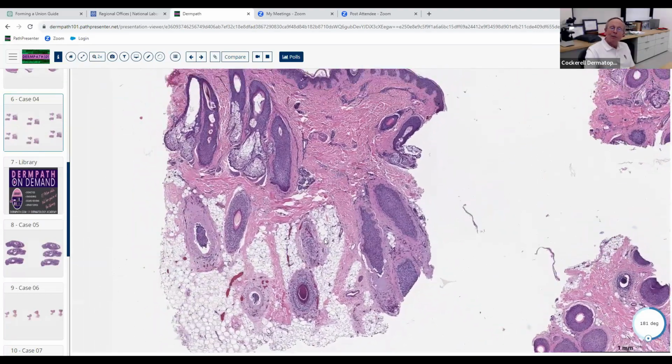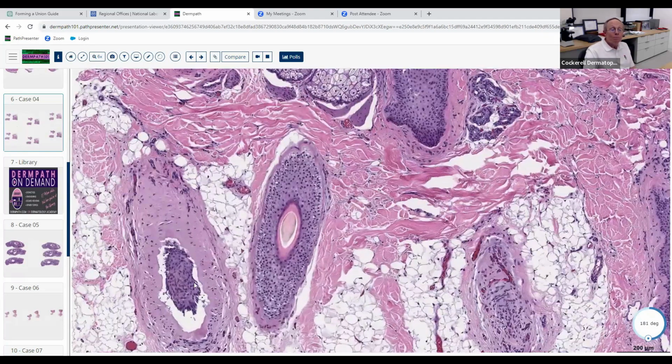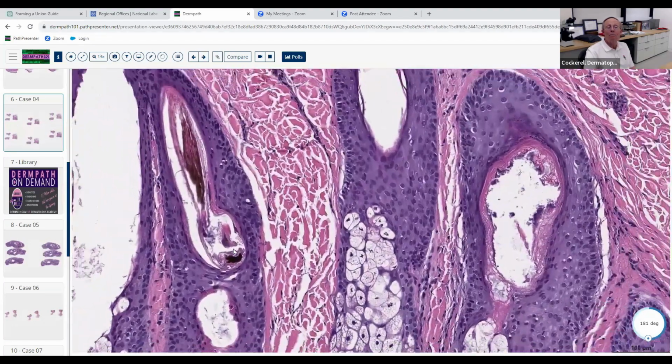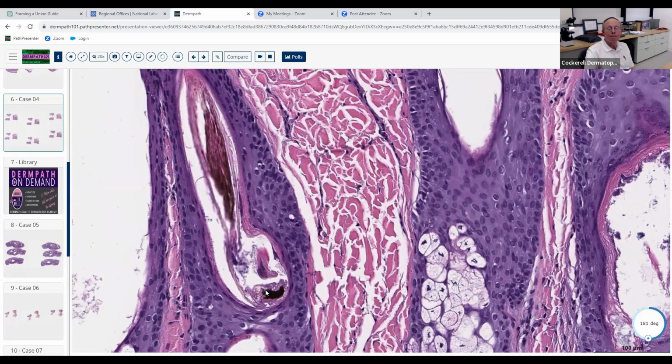Now, what non-inflammatory alopecia do you know that gives you follicles in lots of different stages of evolution, maybe some possible fibroplasia around here? There's a crack between this hair follicle and the perifollicular stroma over here. We've got this finding here, which is pathognomonic of this diagnosis. So what am I pointing out here? The isthmus? What's this thing I'm pointing to? Is that part of the hair shaft? That's the hair shaft. Now, does that look normal to you? No, it looks kind of dark.